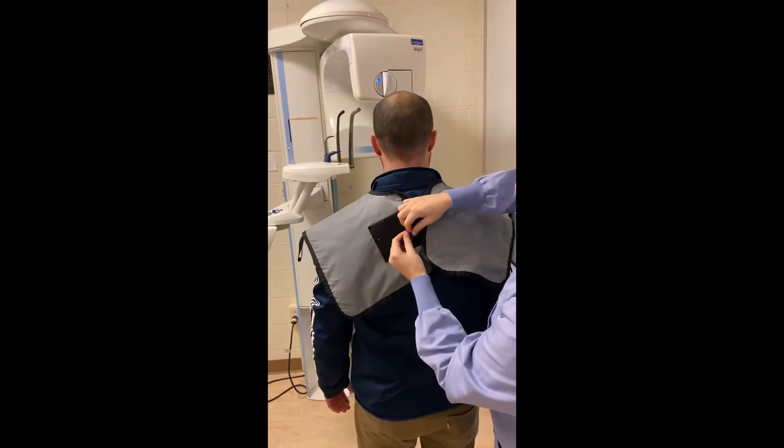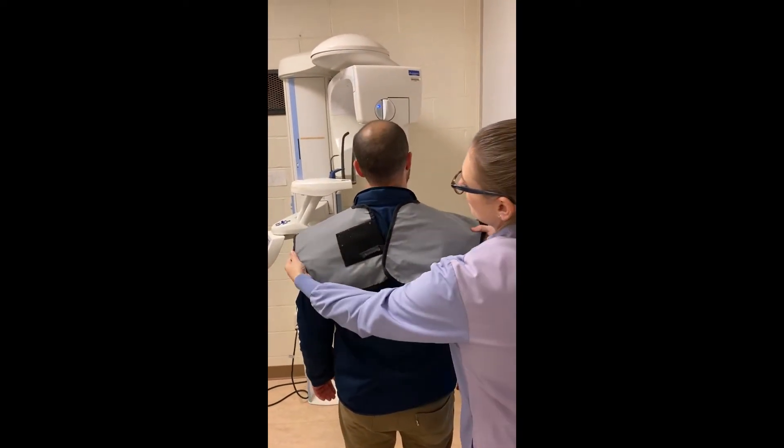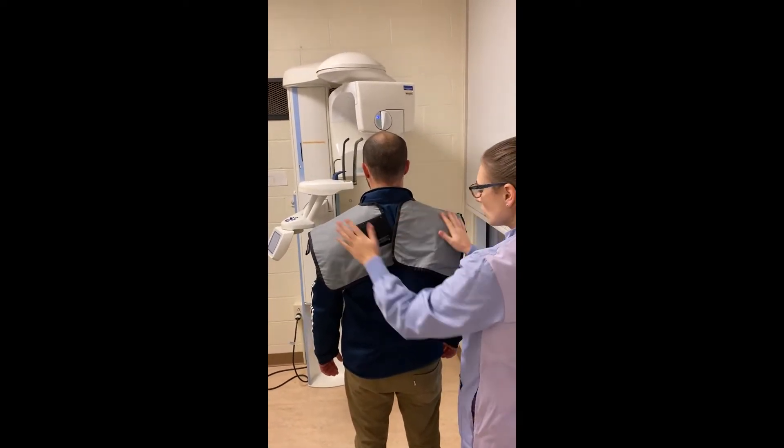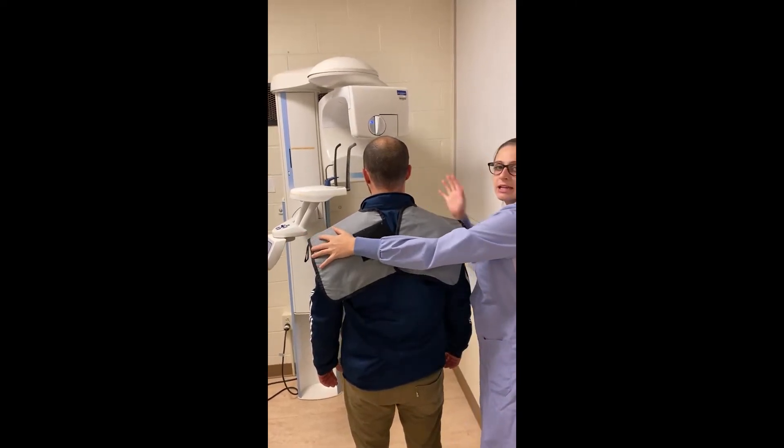When we secure the apron, we're going to use the apron extender to leave a V-shaped opening in the back. Once we have this V-shaped opening, we're going to ask the patient to step into the machine.